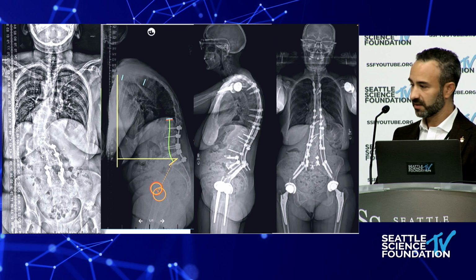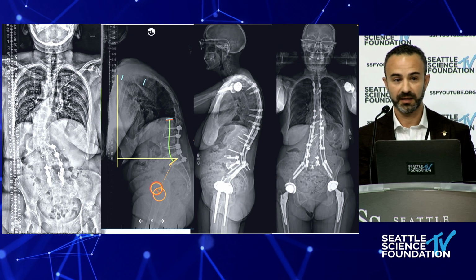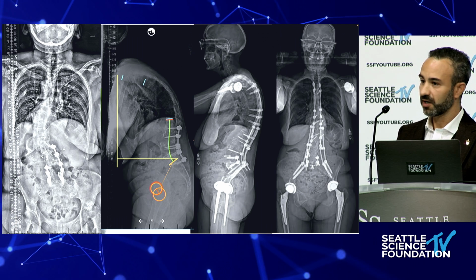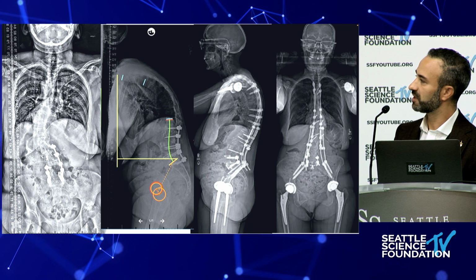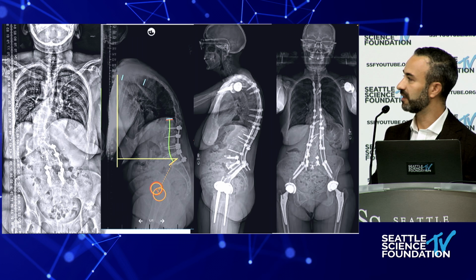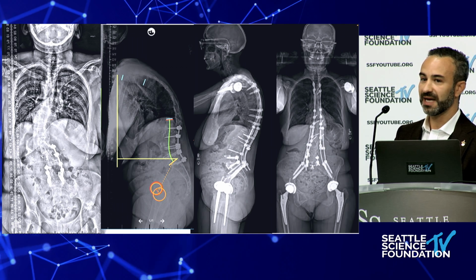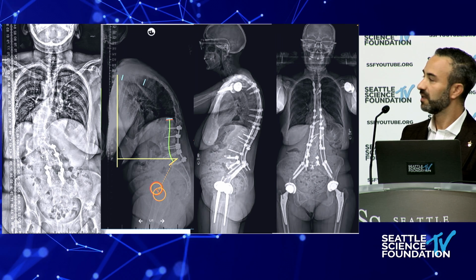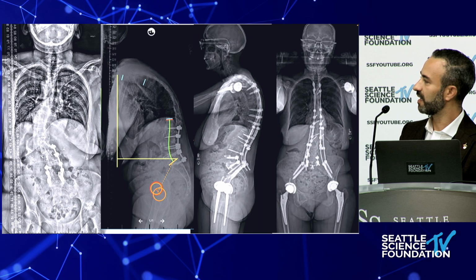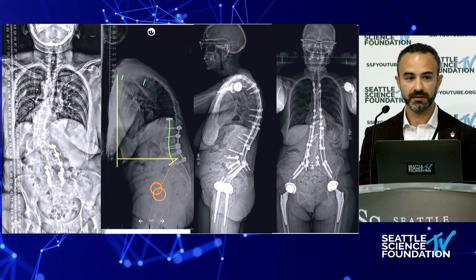And these are the final results. And since we had a very nice talk regarding multiple rod constructs, even in my ALIF constructs, I'm using a short satellite-type rod to hold the ALIF in place, and that allows me to not put as much bend in the distal aspect of the primary rod, and also with satellite iliac fixation to dial in the coronal alignment.